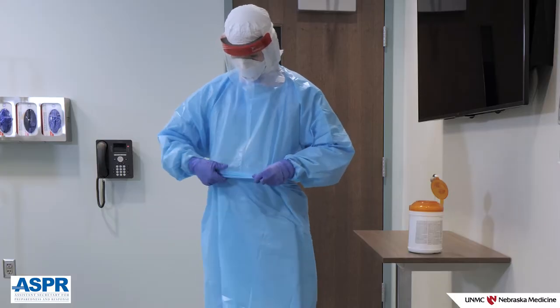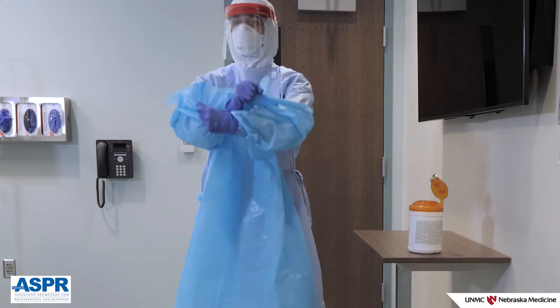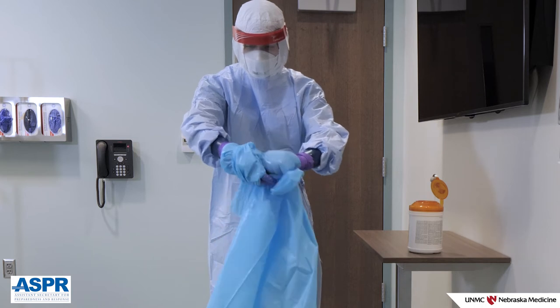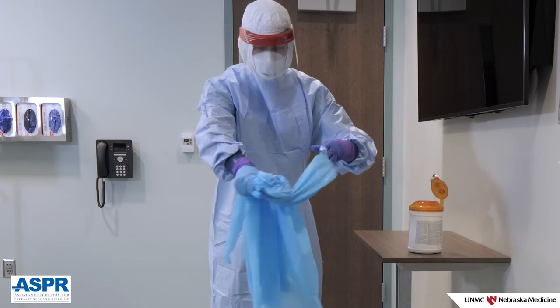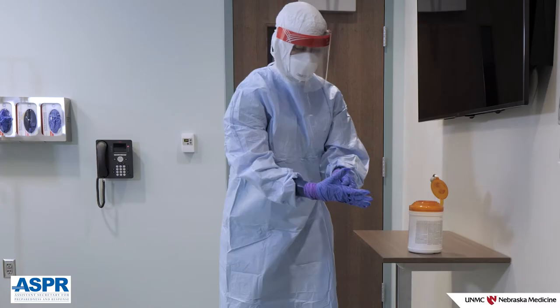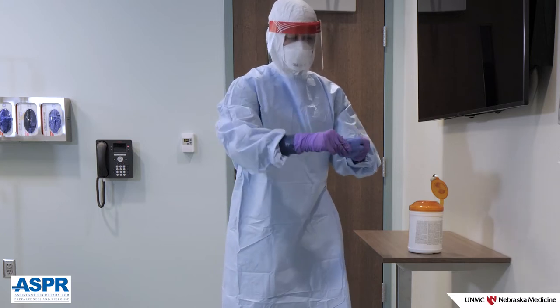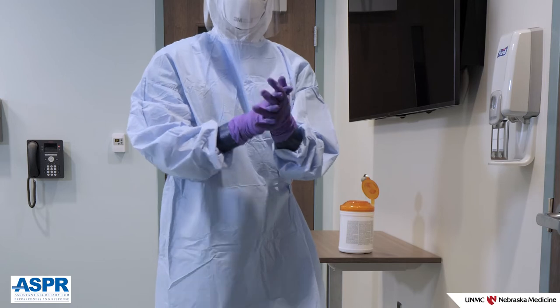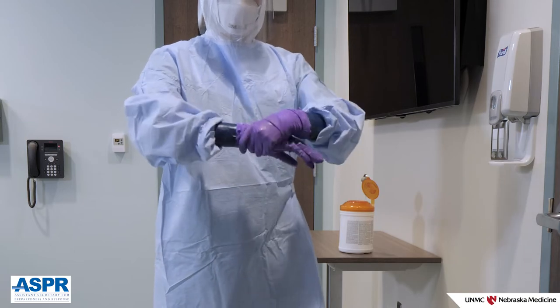Grasp the apron at hip level and carefully pull outward to break the tie in the back. Grasp at chest level and carefully pull forward to break the upper tie. Roll the apron in on itself so that the inside of the apron is the only surface exposed. Place the apron gently in the waste container. If thumb loops are used, you may find that your patient care gloves are removed as part of the apron removal process. If not, remove your standard patient care gloves using a consistent method such as glove-in-glove technique. Gloves and other waste should be disposed of gently to avoid aerosolizing any pathogen present on the PPE.